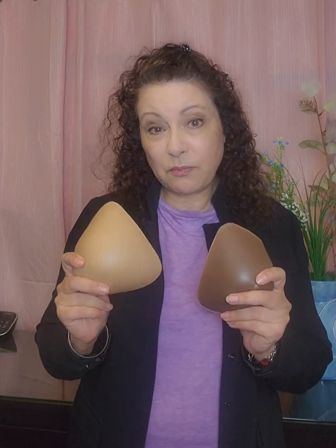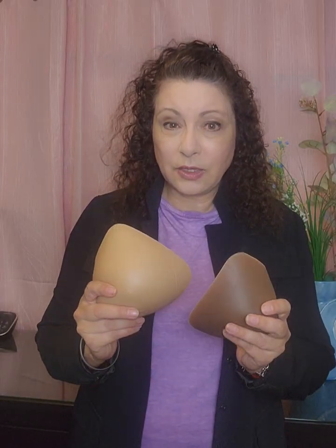So trust the process. Go to a proper fitter who is going to be able to fit you with a surgical grade silicone breast prosthesis, because these are really the best ones. These are recognized all over the world, and in places like Canada, where I am, these are the only ones approved by the government, for good reason, because you do want that weight. Let's say you're a single mastectomy and you have a breast on one side and not on the other. It's important to have a weighted prosthesis because it gives you the balance, right? Because you don't want weight on one side of your body and not the other. So there's a lot that goes into it.